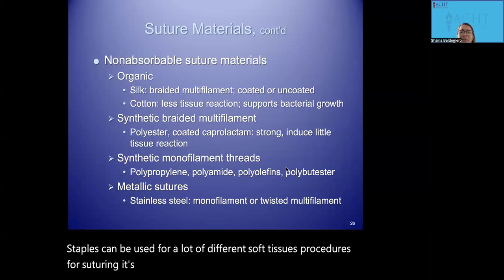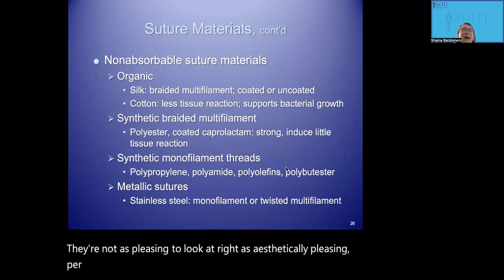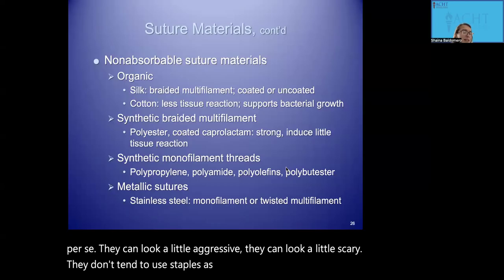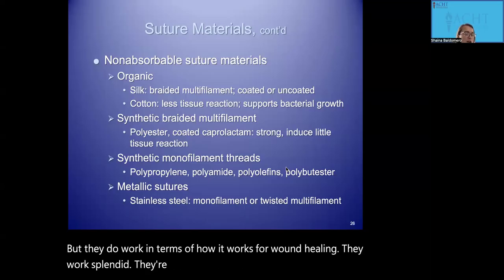It's just not as common because they're not as pleasing to look at, right? As aesthetically pleasing, per se. They can look a little aggressive, they can look a little scary. They don't tend to use staples as often. But they do work in terms of wound healing. They work splendidly. They're a fantastic option.